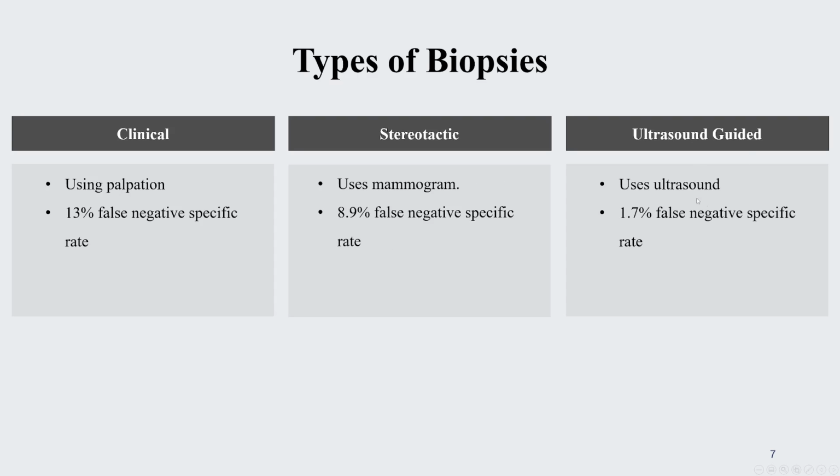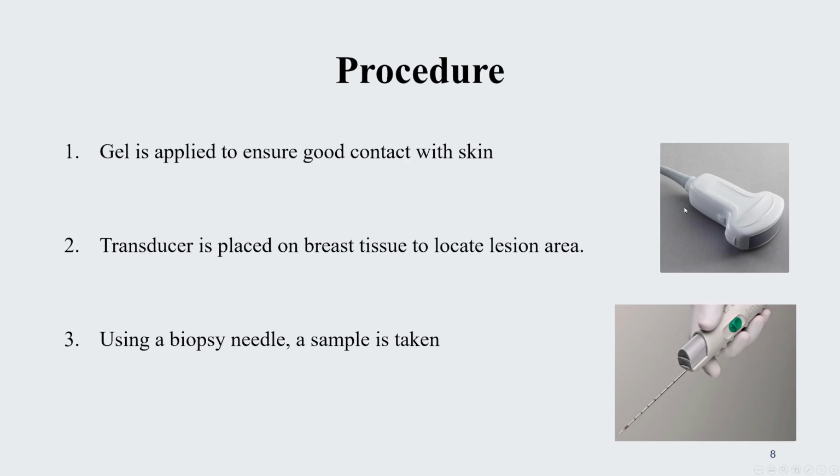For ultrasound guided, it uses ultrasound and it allows the doctors to see the needle as it's going into the tissue. And it had the lowest rate of false negatives at 1.7%.